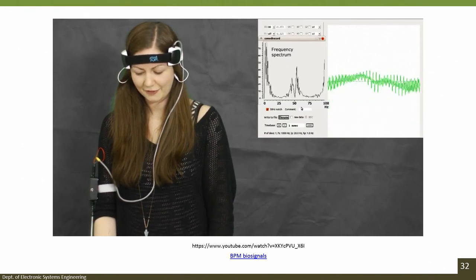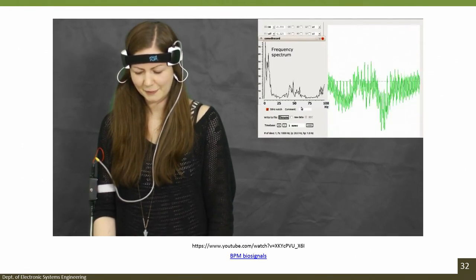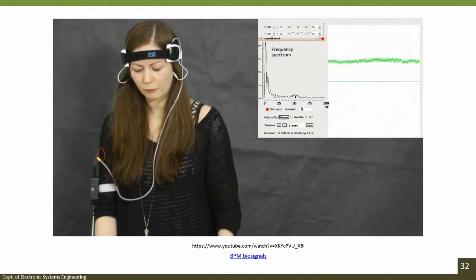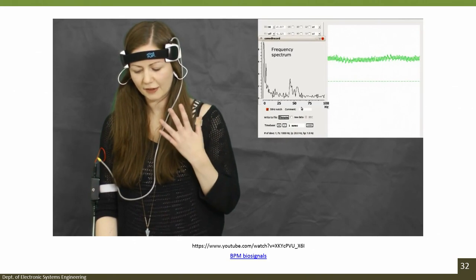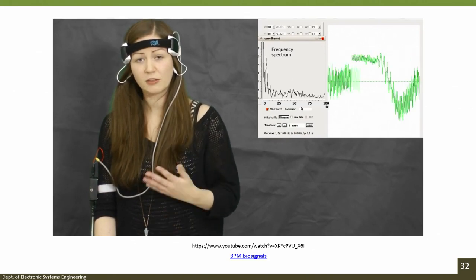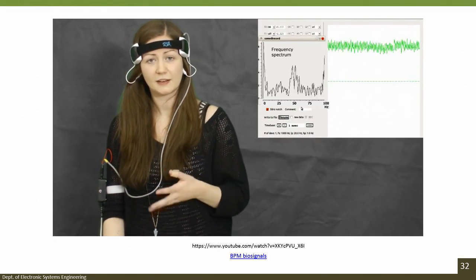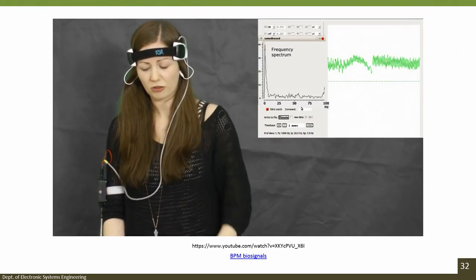And that's definitely having an effect on the signal. But it's still very noisy. There may be some EEG in there, but just using the dry electrode, we're not getting a good enough contact with the skin. So what we can do is leave this for 10 minutes and see if we can get a cleaner signal after we've got a better connection.